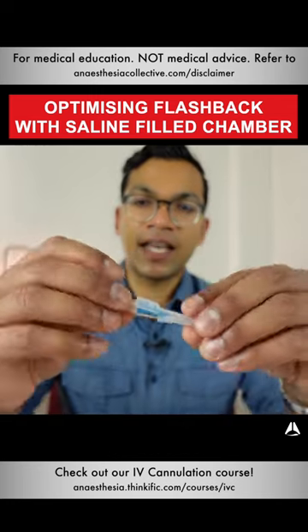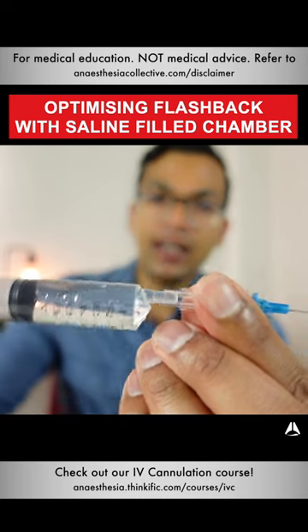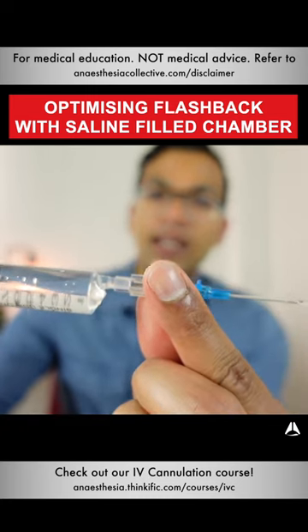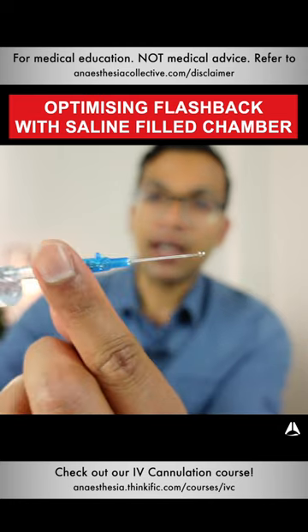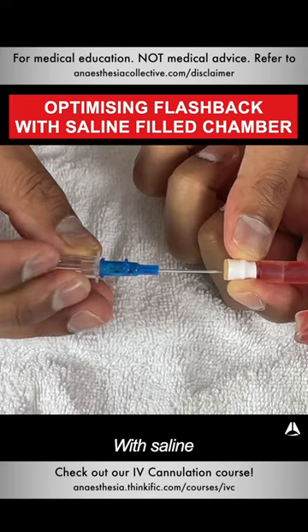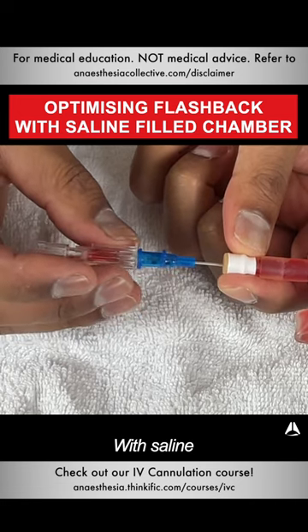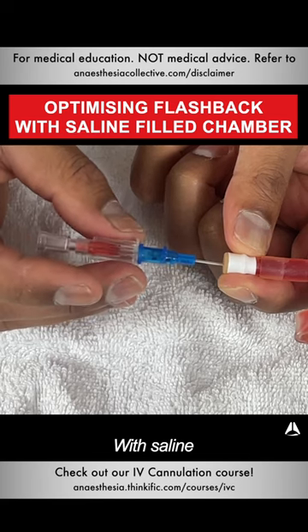In the second demonstration, I take my cannula, uncap it as normal, then take a syringe of saline and simply put saline into the chamber until it drips out the other side, as you can see. As I enter the vein, you'll see a different quality to the flashback — it kind of squirts out the other side.